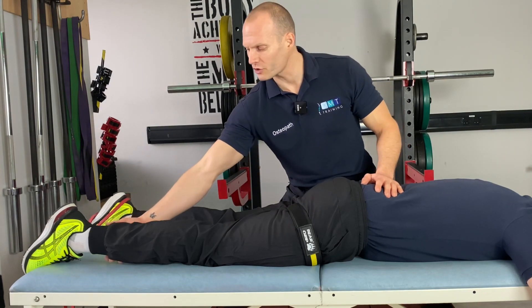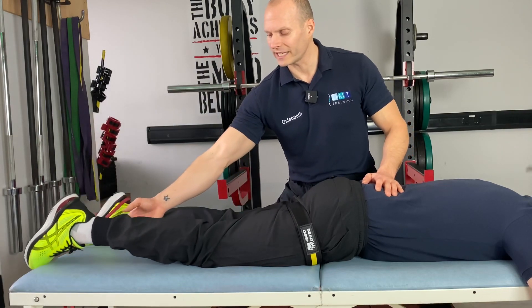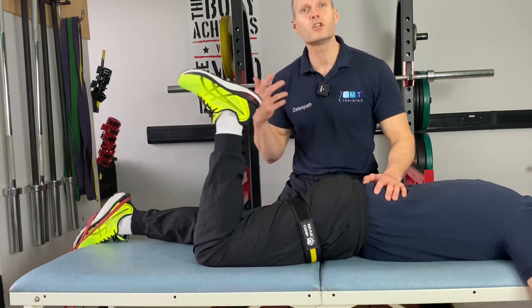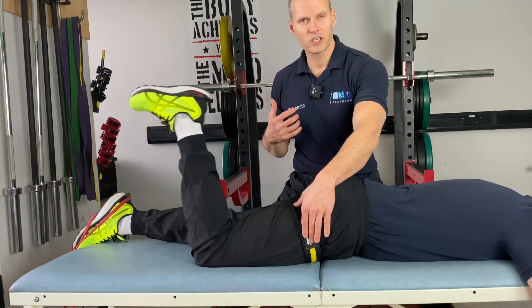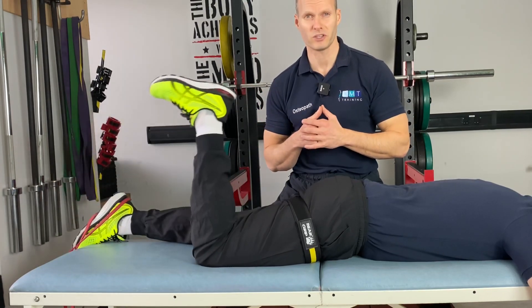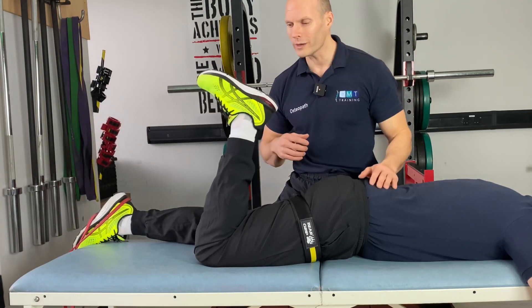Initially we're going to get the patient to go through the hamstring movement on their own. From here, we get them to come up all the way as they can and go through that hamstring contraction under control with their own body weight. We have the restriction of the limb and we have now started to elicit those mechanisms around blood flow restriction hypertrophy.